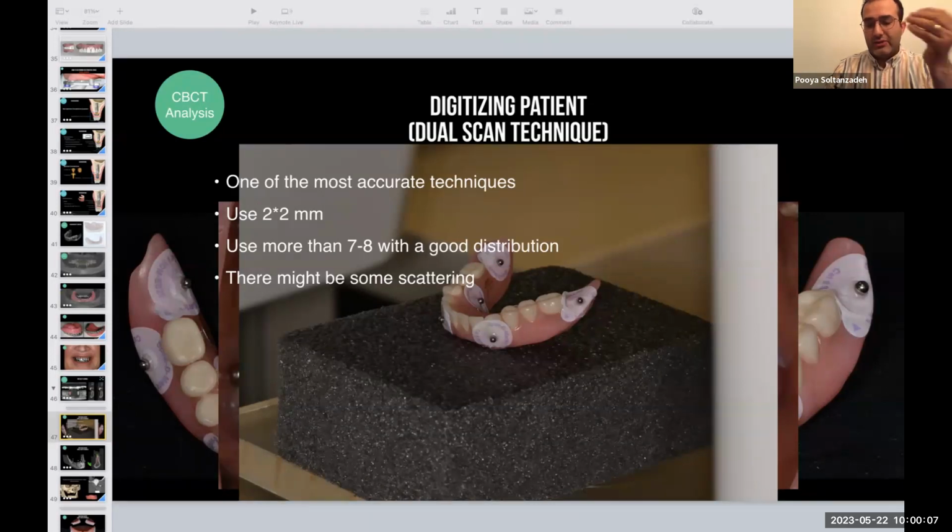And then based on that, you have the outline of the denture, and you can design the implant position, the locators, all-on-4 or whatsoever, and it gives you a good amount of thickness, and everything would be very accurate.